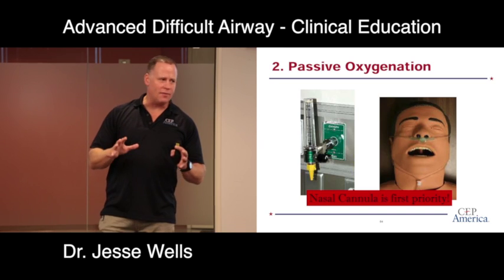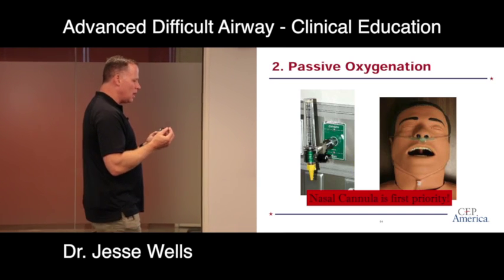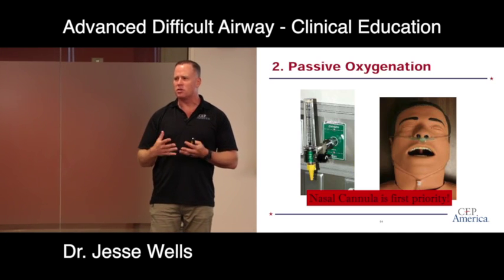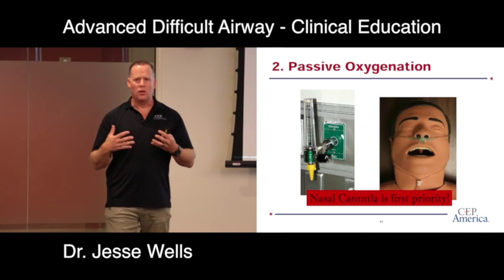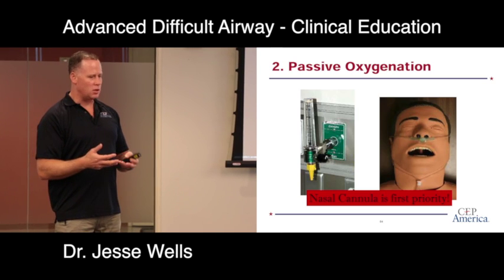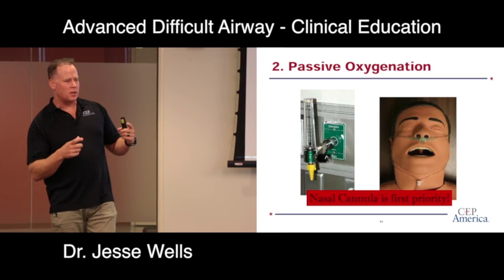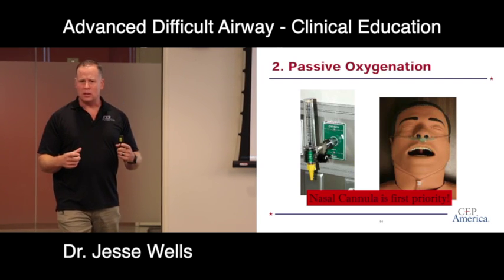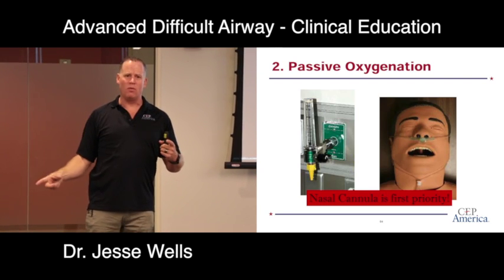Now, they make a high flow nasal cannula. You can use a regular nasal cannula, but because of the softness of the tubing, you're not delivering the true 15 liters. Some is basically restricted flow because of the design of the tubing. There is high flow nasal cannula tubing that can deliver 15 liters per minute. My RT manager says that high flow nasal cannula only costs about 30 cents more than the regular nasal cannula.